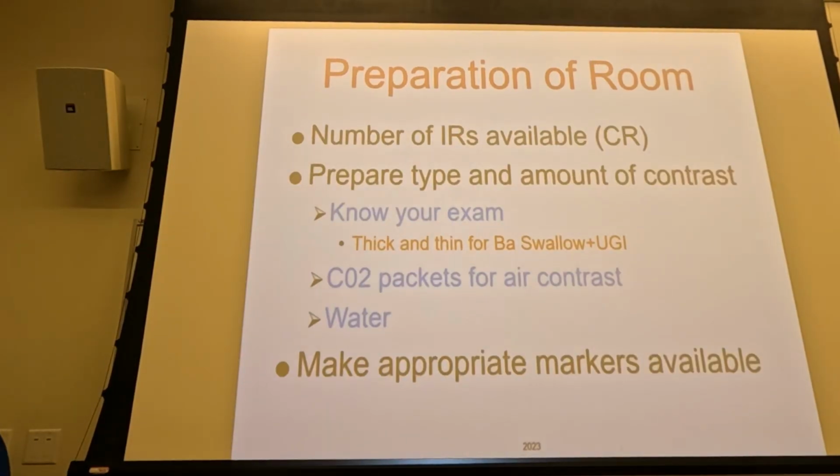The number of IRs available really should come out of this PowerPoint presentation. That was from whenever we used screens, films, CR, whatever. But the rest of it is still applicable.